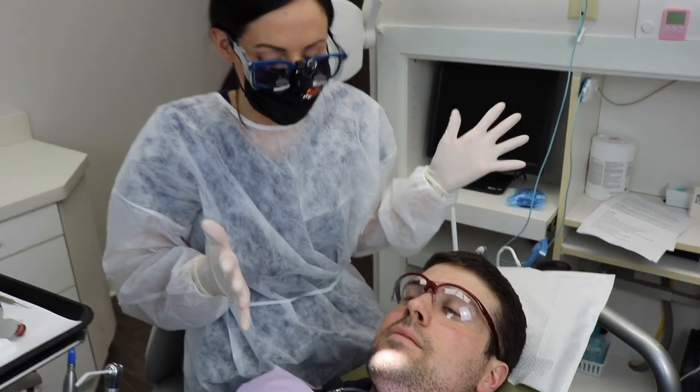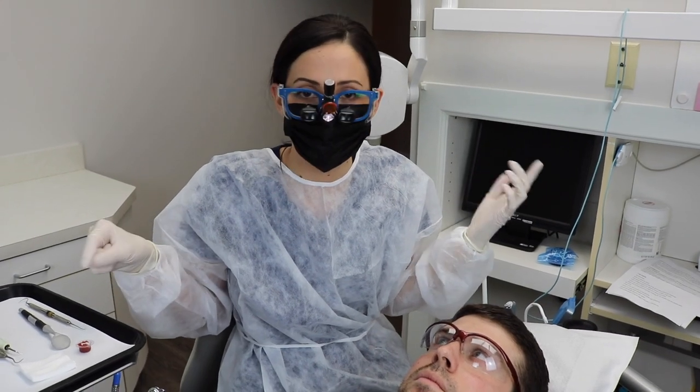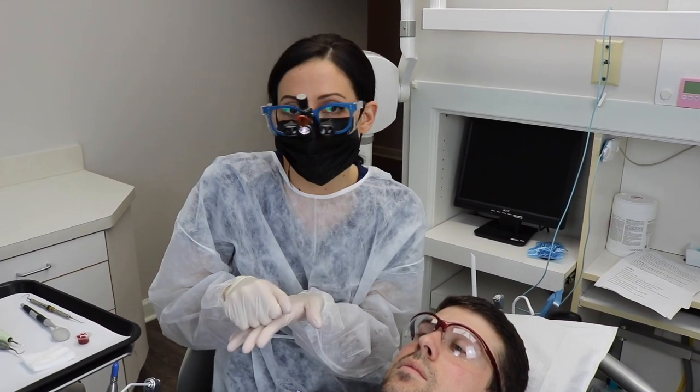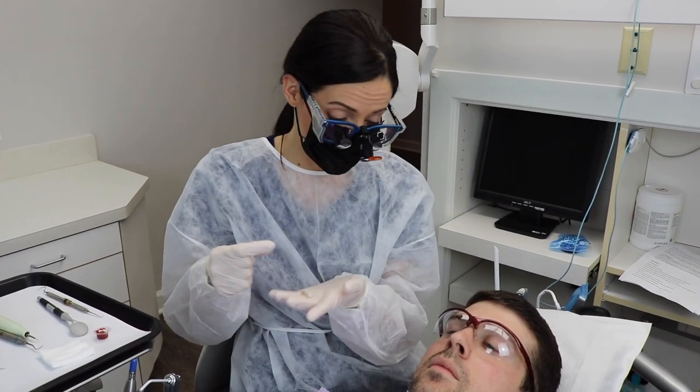My biggest thing is I try to use a minimal amount — a little goes a long way. It depends which brand you're using, but the brand I'm using does a good job polishing. If you like to use a lot or you accidentally use a lot, use the little trick where you can flare it off the cup right onto the incisal edge so you waste it and it doesn't get everywhere.